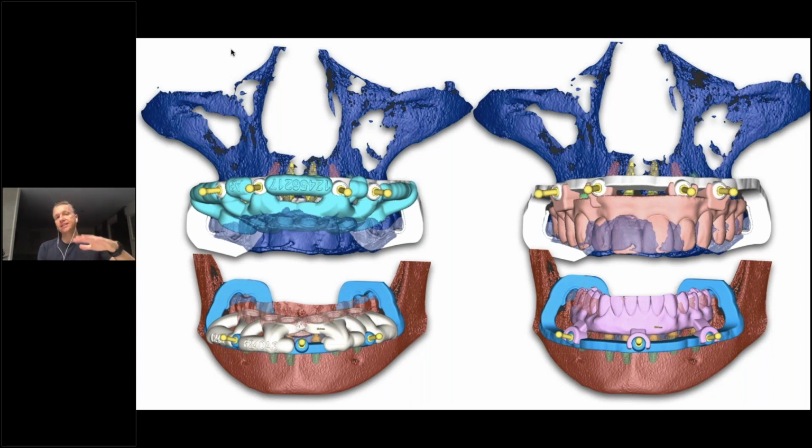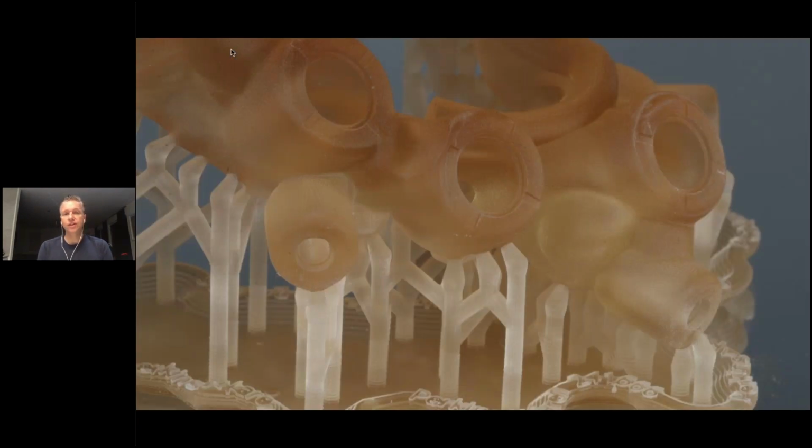The bone reduction guide stays in place, and I can now place the temporary on that bone reduction guide and convert that temporary basically to a screw retained immediate provisional in the patient's mouth on day of surgery. That's the goal. Now for her, we did that. So we fabricated all these devices, surgical guides, surgical guide fabrication and temporary. And that is basically a few days after surgery.